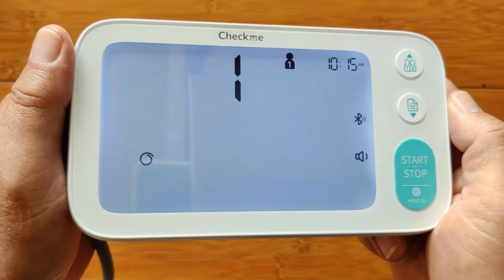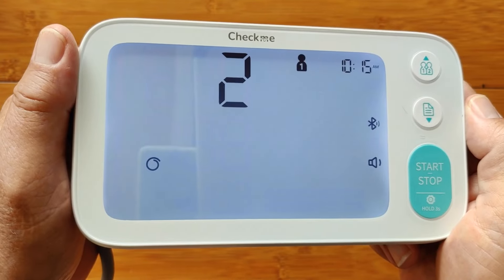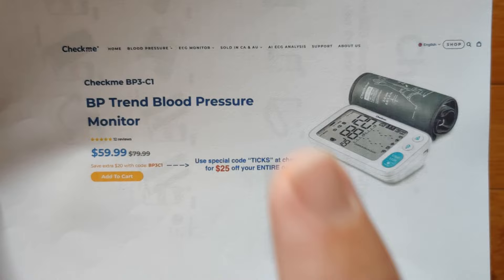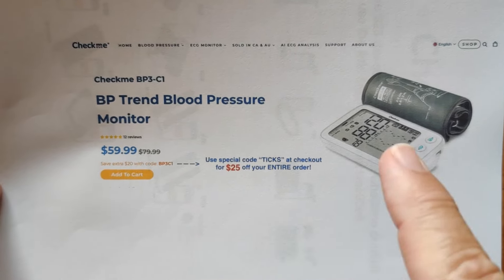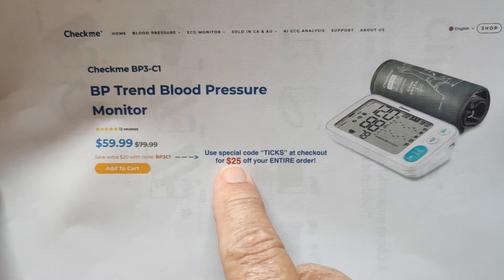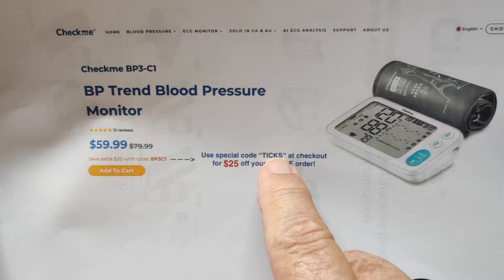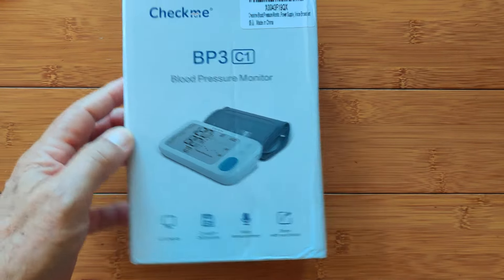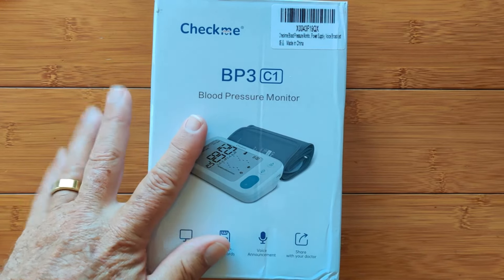Greetings and welcome to SmartWatchTix.com. Got a treat for you today — it's an inexpensive blood pressure monitoring device with lots of features. CheckMe, a company whose products we have reviewed before, has a brand new blood pressure monitor.